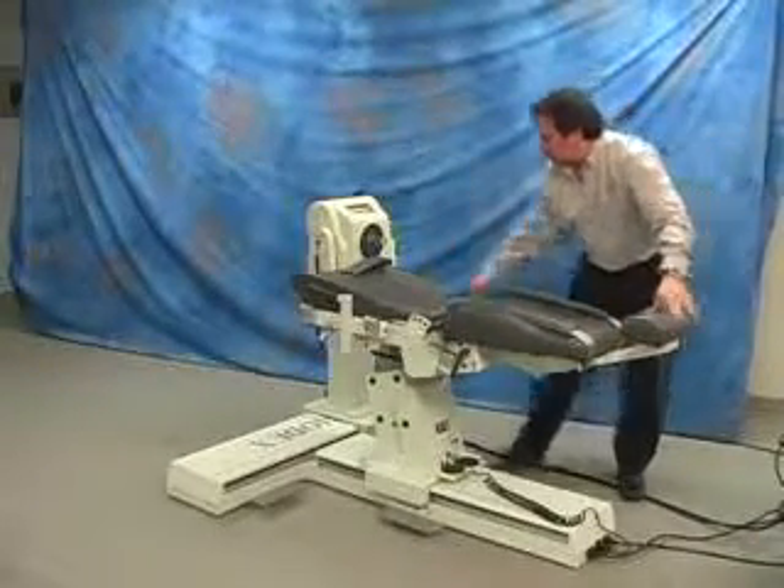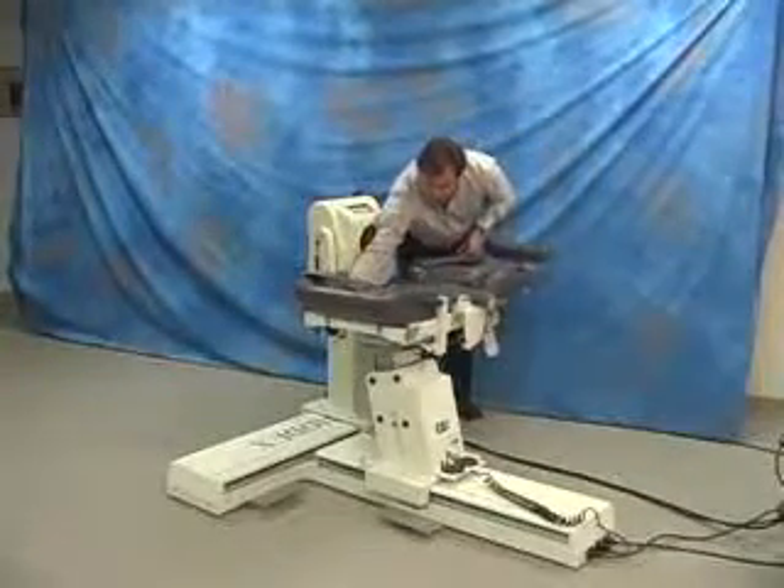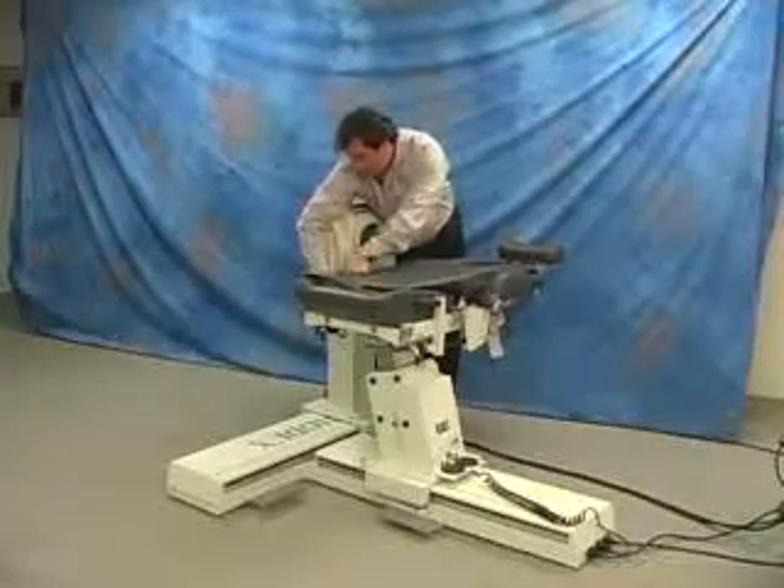Decline the chair back to 0 degrees. Rotate the chair to 0 degrees. Apply chair spacer pad if available.